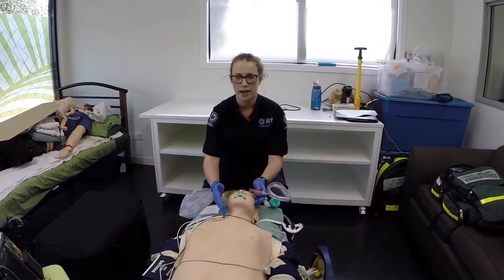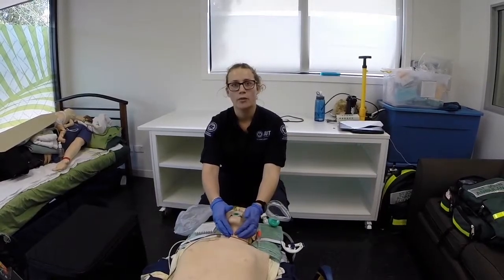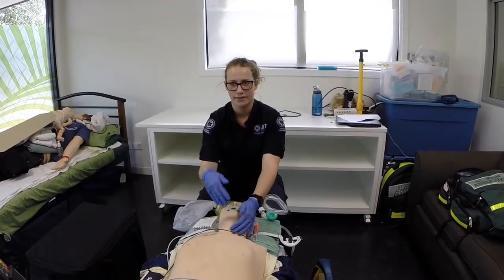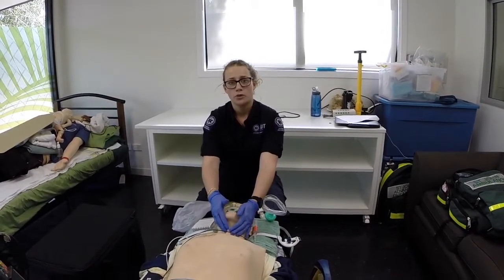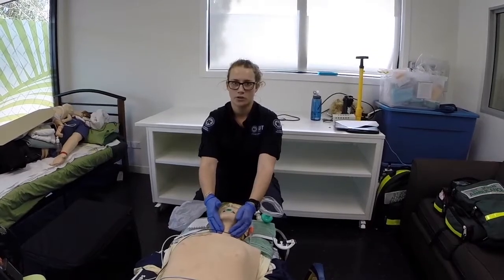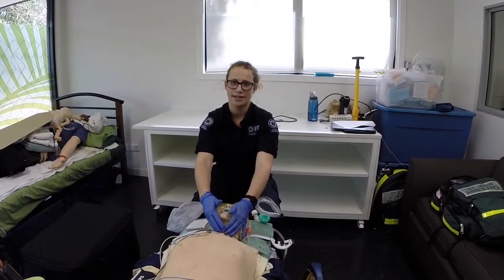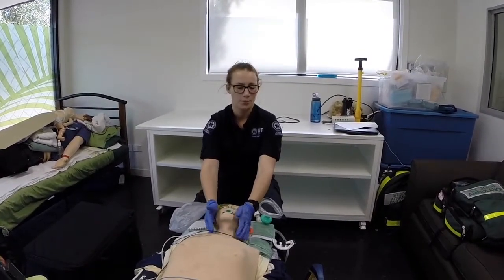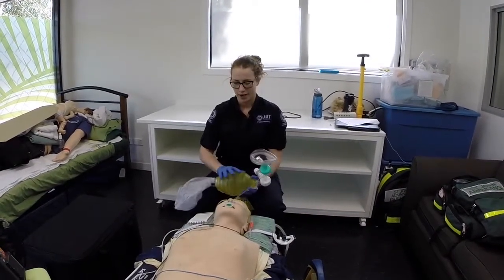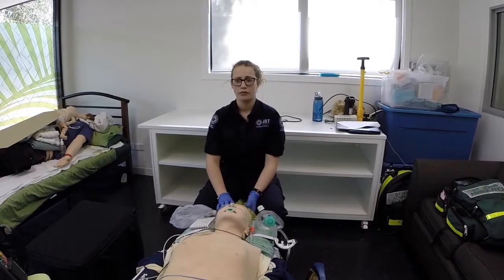So that is the backwards, upwards, rightwards pressure of the trachea, which will help the visualization for this RSI officer in the intubation, as well as a bougie, which will keep the ETT tube rigid during the intubation process, as well as a cricothyrotomy, which is a last resort for this patient if intubation were to fail. As well as we've got all our resus gear ready, like our BVM, we've got the pads attached, and we've got all our other gear ready if resus is required.